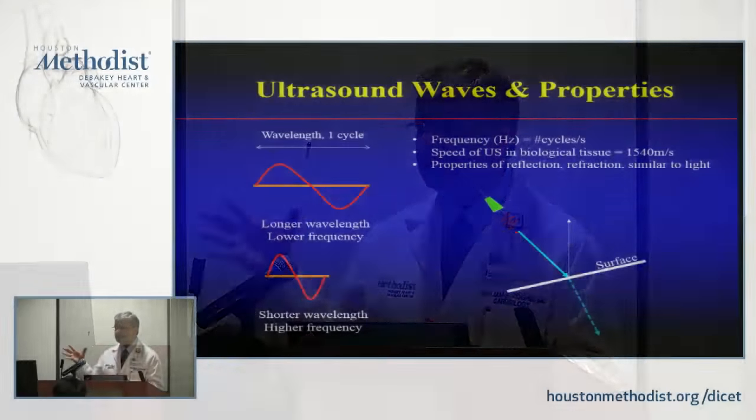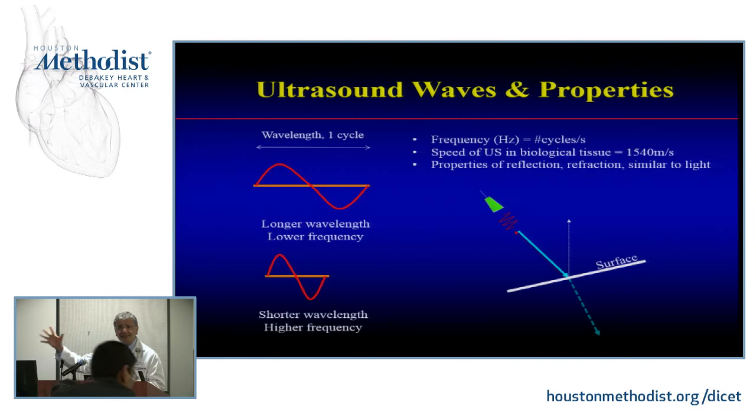So you have to send packets, because if you grew up in the mountains or in a valley, that's the same principle. You have a little shout, and then it goes out, and then it comes back, and actually if you're smart enough, you can tell how far this valley is. Same thing, there's another application. If you see lightning, right, and then you hear the thunder afterwards, you can actually tell how far this cloud is, because the speed of light is very different than the speed of sound, right?